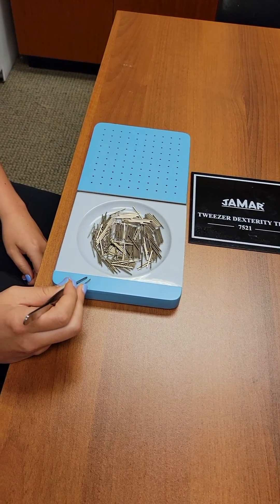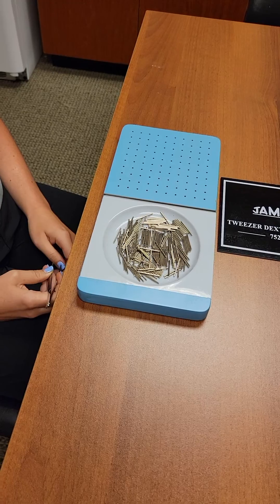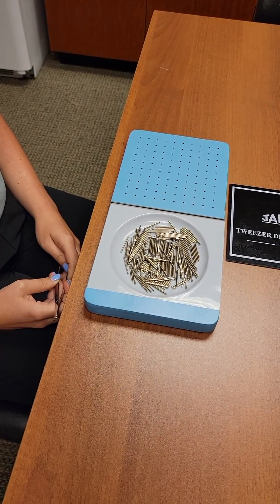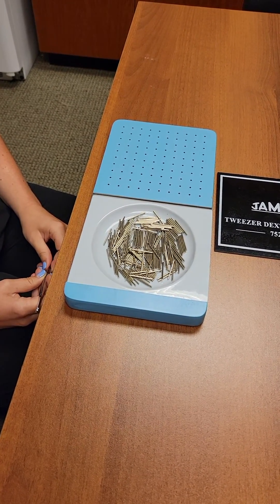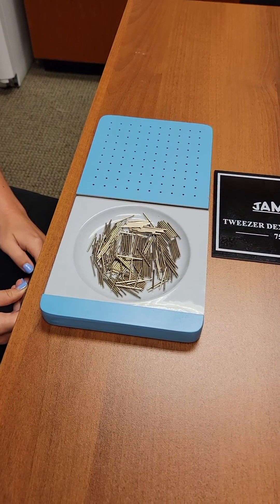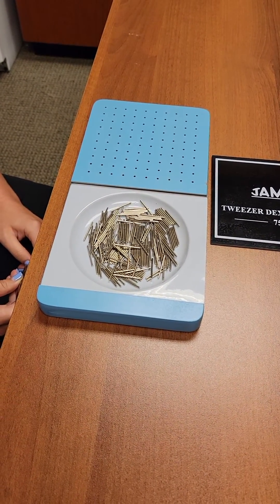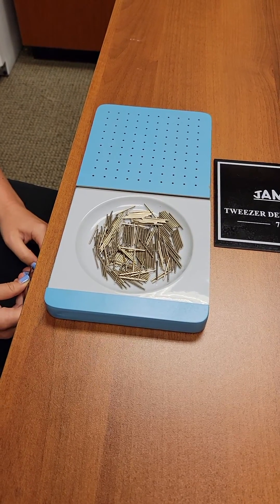This would be a test that you could possibly use for an office worker, a store employee, or a mechanical worker. It is a longer test, so we're going to just do two rows — where normally there's a hundred holes and the person would take the tweezers and put in all hundred pegs.